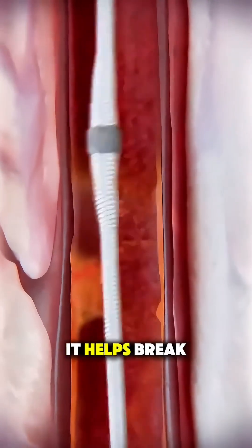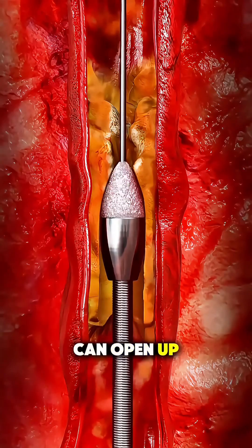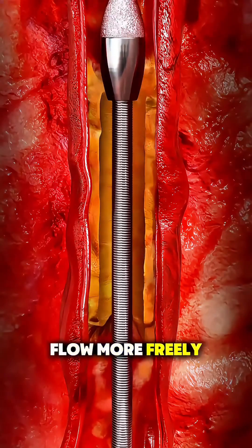As the device works, it helps break down or remove the plaque so the artery can open up and let blood flow more freely again.